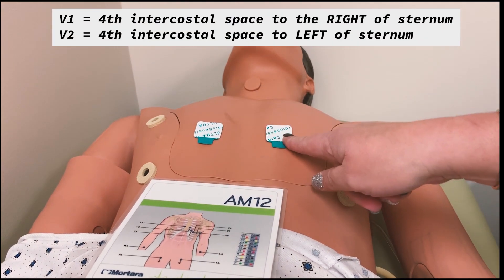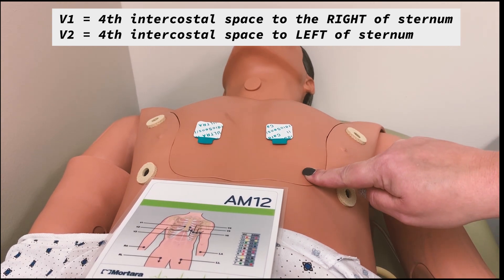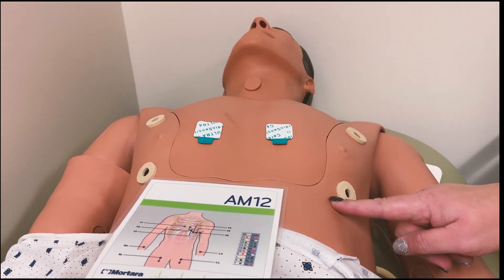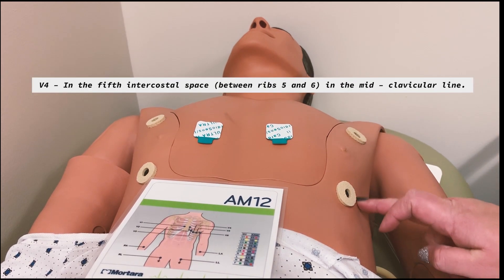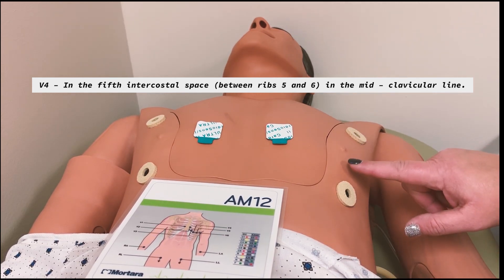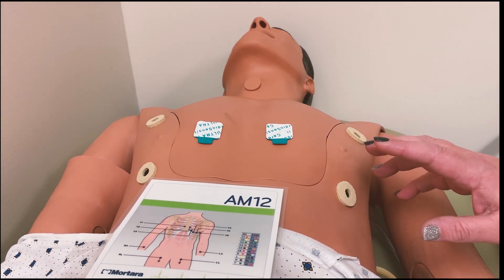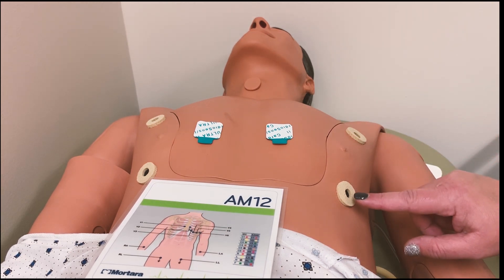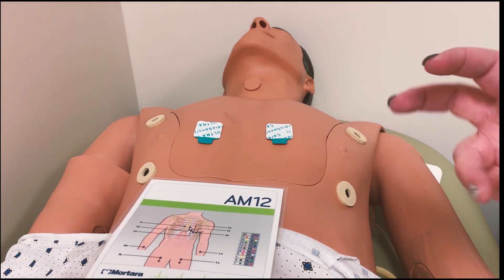So I've got one, two, then I skip three — I know that's going to go about here — and I put four. V4 goes about the fifth intercostal space. You can poke and feel the spaces. You don't want an EKG lead on a bone because that can cause interference with the reading. So you want to avoid putting it on top of a bone — that's the reason for putting them in intercostal spaces, the spaces between the ribs.